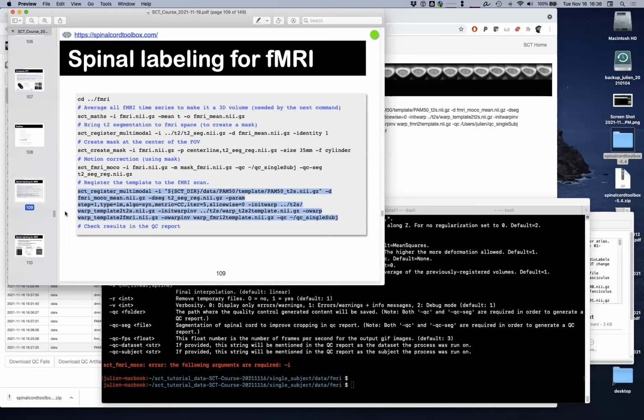Right. So again, boring answer is it depends on the data, and it depends on the hypothesis. For example, if you're looking into clearly distinguishing the ventral from the dorsal horn of the spinal cord in your GLM results, then you might want to avoid a strong and big kernel in the in-plane direction, right?